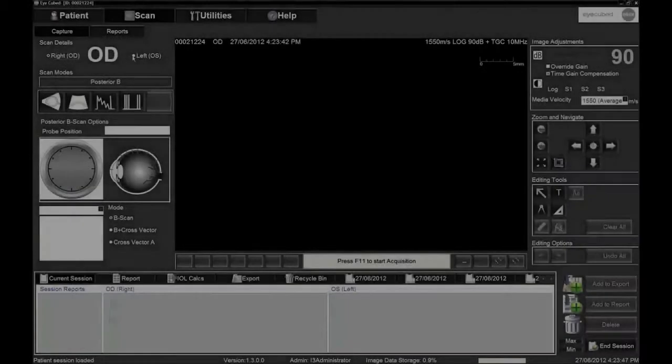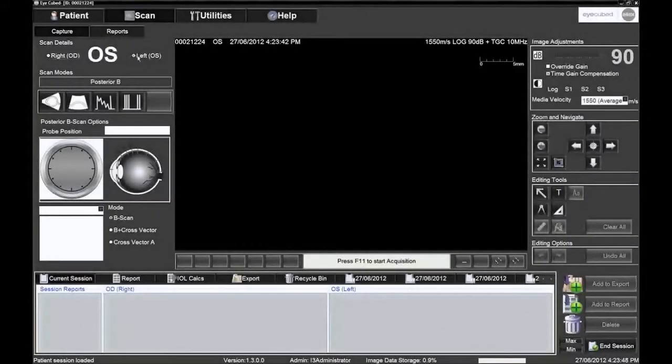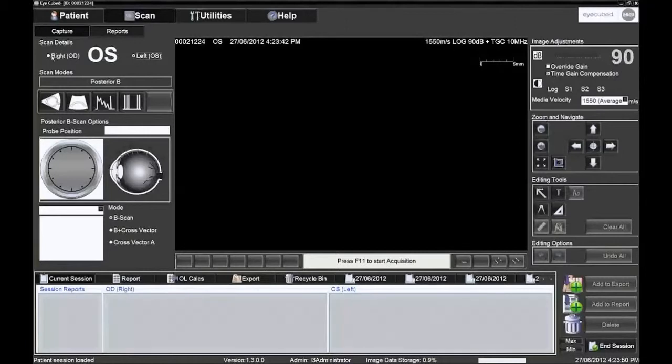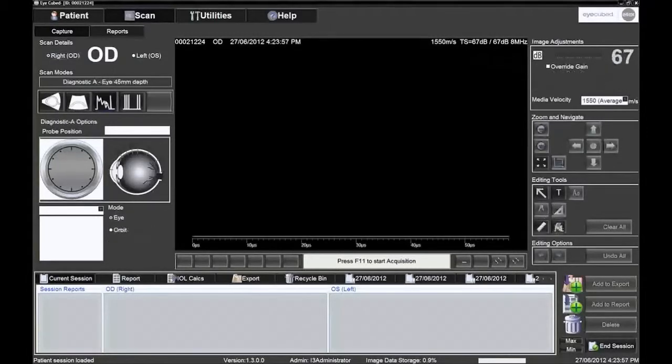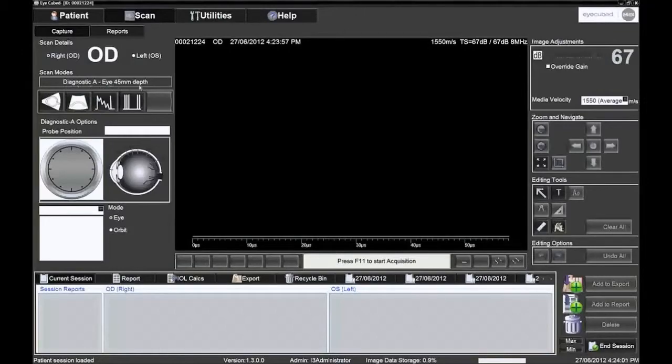Choose the eye to be examined by clicking on OS for the left eye or on OD for the right eye. Choose the scan mode, Diagnostic A-Scan, by pressing F3 or by clicking on the third icon under Scan Modes.